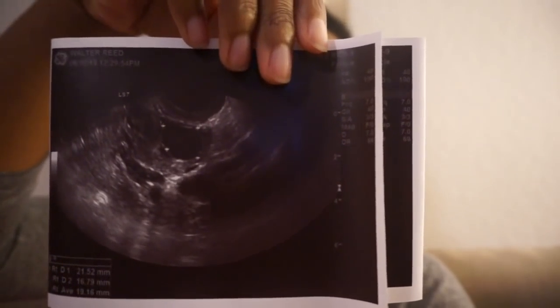I was almost about to get discouraged, and my sister was in the room, so it wouldn't have been too bad, but I was like, oh Lord, because I wasn't really feeling anything on the left side. But when she turned the probe, I was like, oh, it's a lot of pressure. So here is my left side. Here we go. Do you guys see that big follicle? Oh my God. My left side had this big follicle and I'm so happy. It was measuring at 19. I have one mature follicle on the left side, and that's all I need.